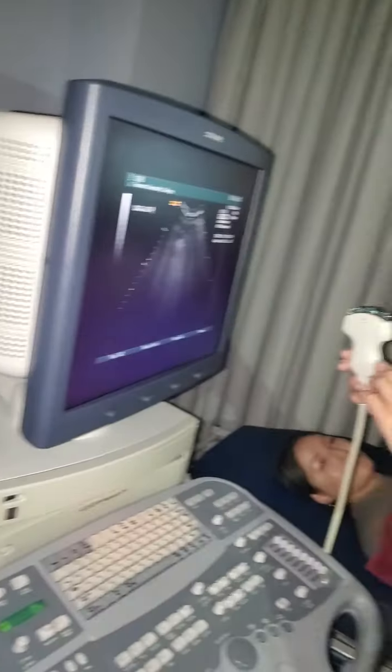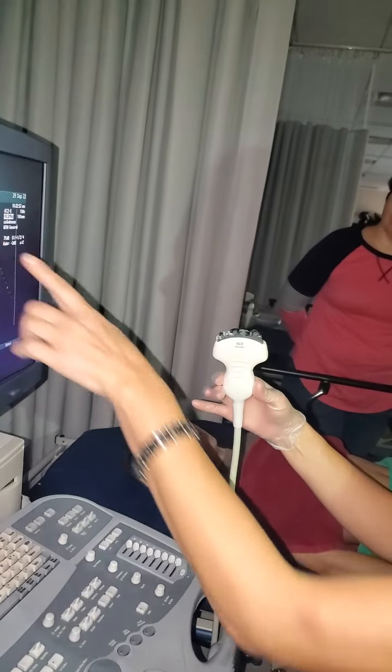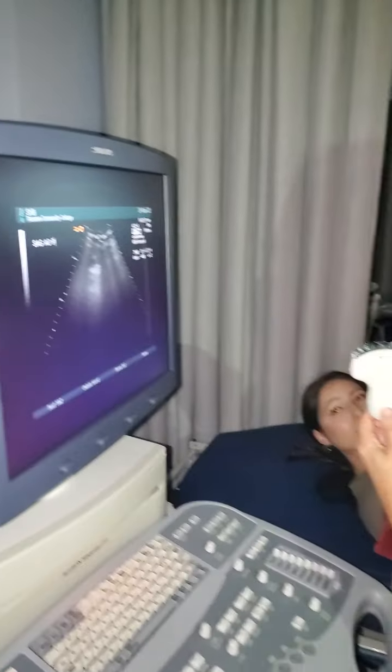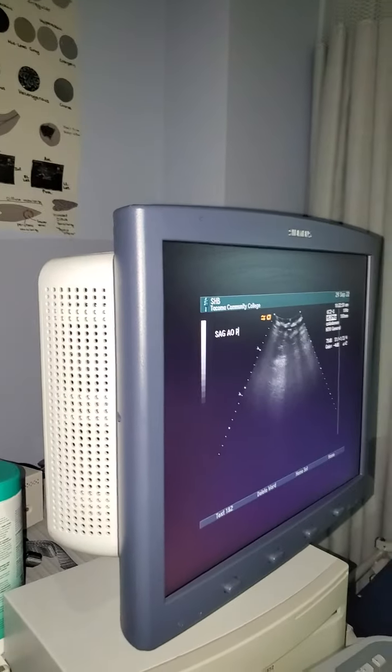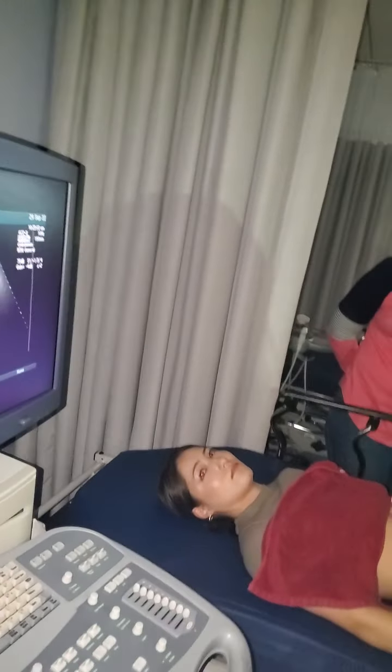And on these transducers, there's always going to be a notch. So this one looks like a little H, and if you're unsure, so this is our home, remember? So I can pet that side of the transducer and see how that side's moving, so I know that's my notch, so that's the part that stays between noon and 9. So we're going to put our probe down.